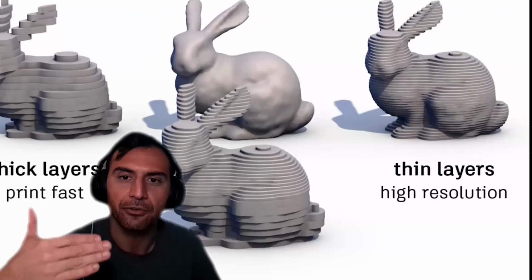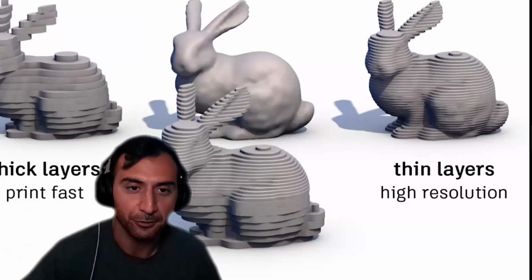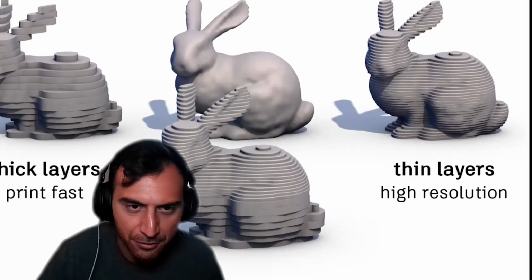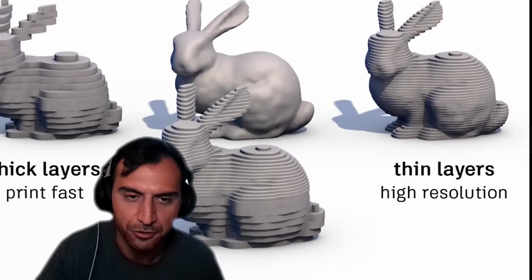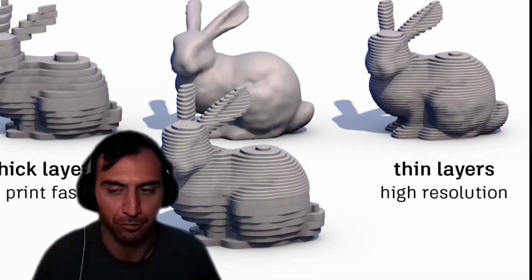The key to it is, can your printer handle it? I'll tell you, most 3D printers print at pretty high resolution, like I said, in the micrometer range. And most of the time they give you a micrometer setting for how accurate, or what level of resolution, you want. The thing is, the resolution is also tied to the speed of the printing.